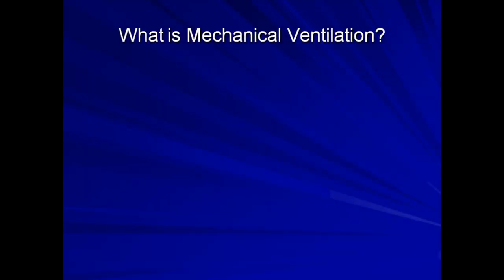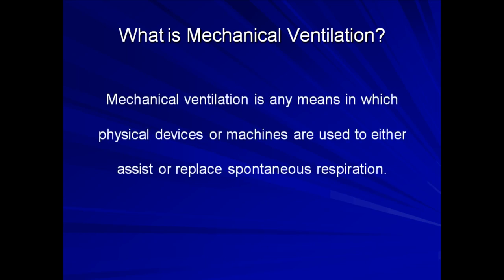As I begin discussing mechanical ventilation in this first lecture, the most obvious place to start is simply to ask, what is it? In the most general sense, mechanical ventilation is any means in which physical devices or machines are used to either assist or replace spontaneous respiration.